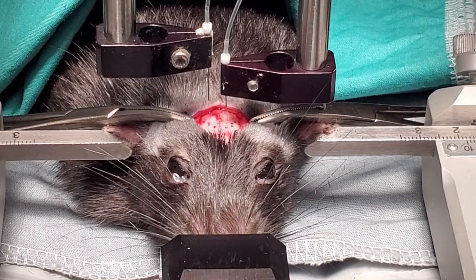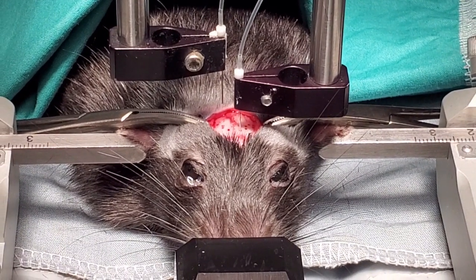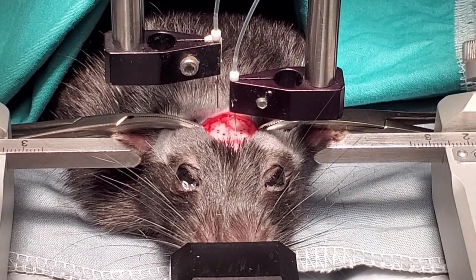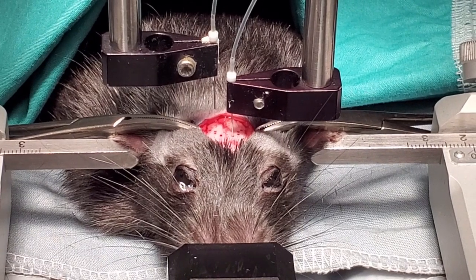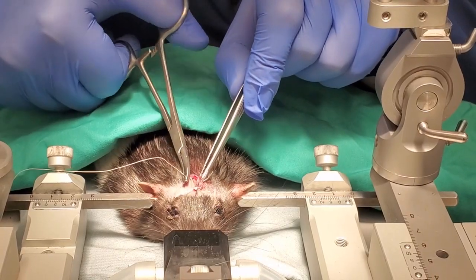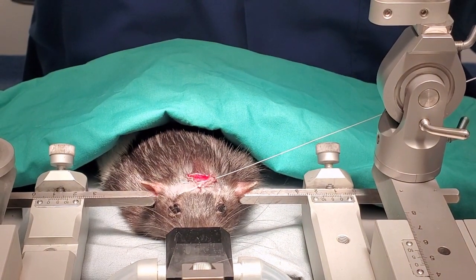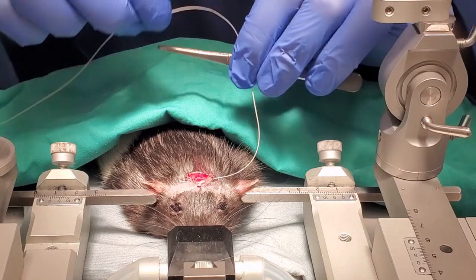For a complete hippocampal lesion, we inject the NMDA into 7 sites in each hemisphere. Even though we only drilled 6 holes in each hemisphere, one of the holes gets 2 injections at different depths. The incision is stitched shut with suture, and the rat is placed in a recovery cage in the anteroom where it will be observed closely.